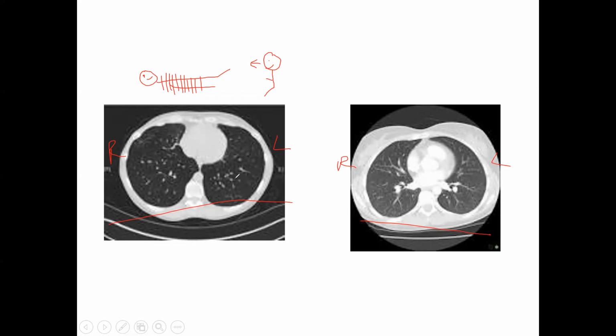And if you ever go on a transport in the hospital with an intubated, mechanically ventilated patient, always take a bag valve mask with you, because if the patient becomes extubated, you want to make sure that you can manually ventilate that patient. So always take a bag and a mask with you. And I would make sure I take a self-inflating bag with me, because if I take a flow inflating bag and I didn't check the pressure on that cylinder before I left and the cylinder runs out, pretty much SOL at that point.